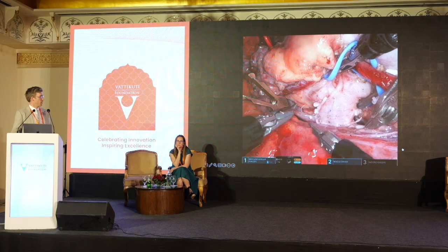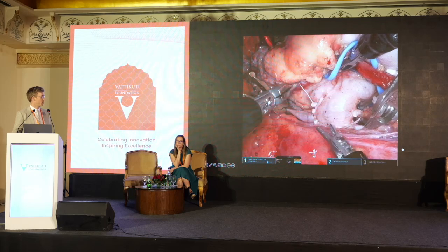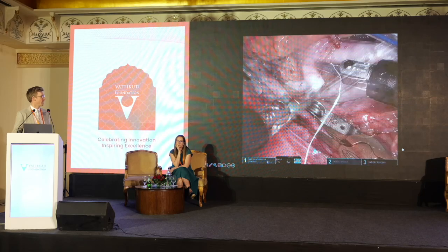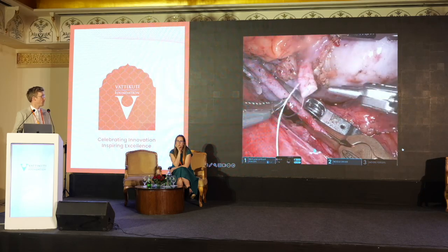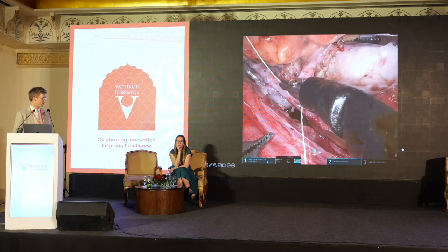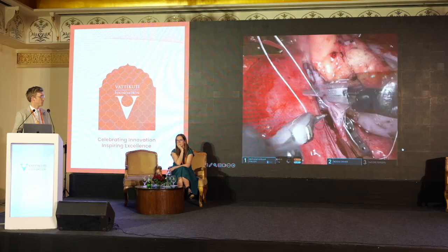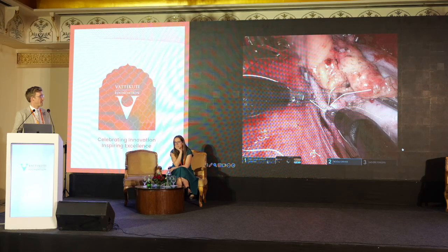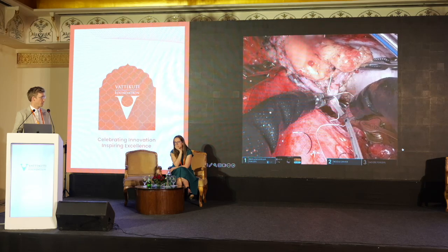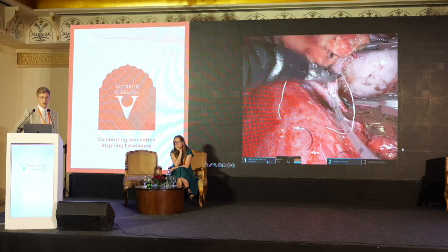So here we finish with the second suture, the same technique as for the previous case, so it's the same surgeon as well, so you see that it makes a lot of sense. Flushing then again to avoid these clots, and then doing the arterial anastomosis with the Gore-Tex 6/0. So a two-sided anterior and posterior wall anastomosis, with after that again flushing before final closure of the arterial anastomosis. So both of them are side-to-end anastomoses.